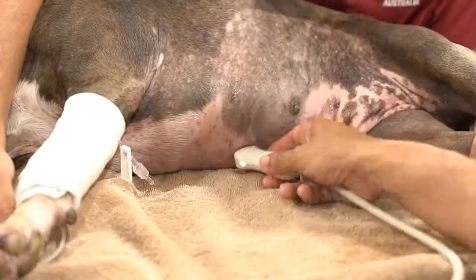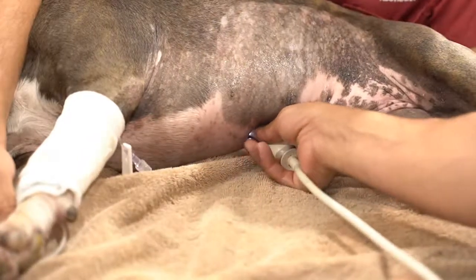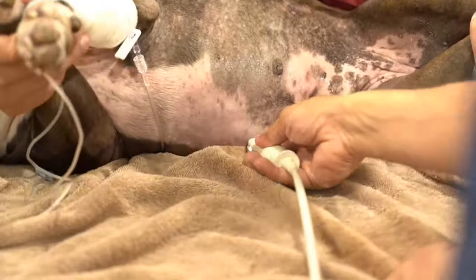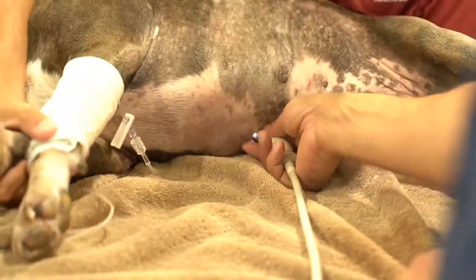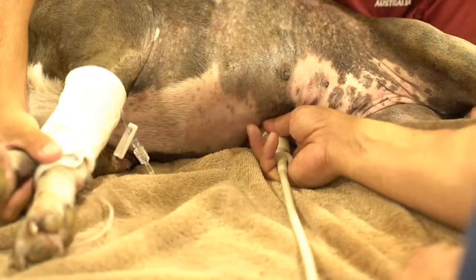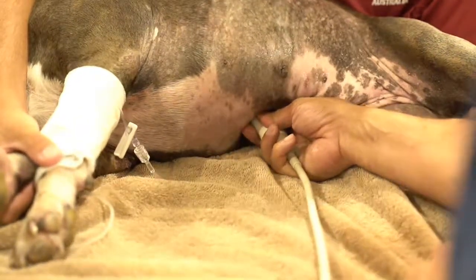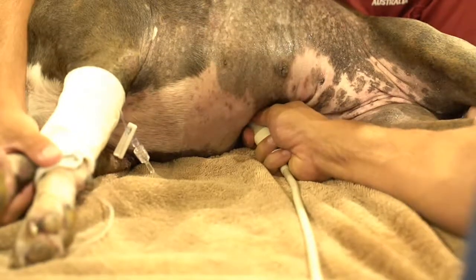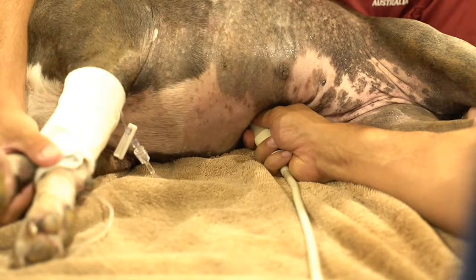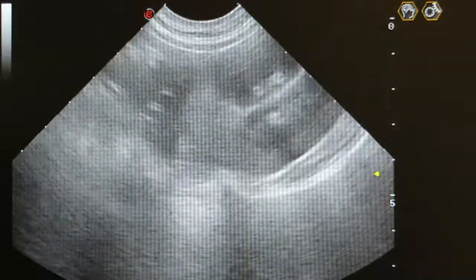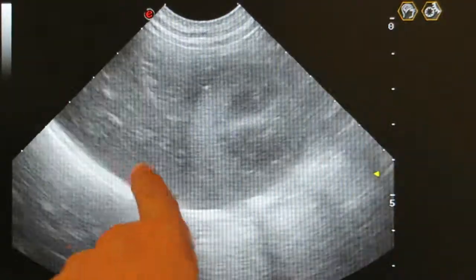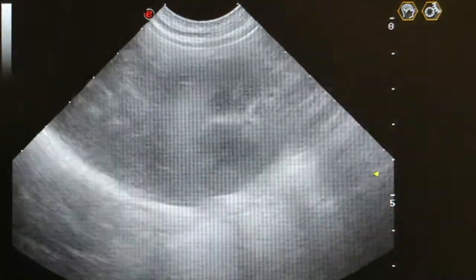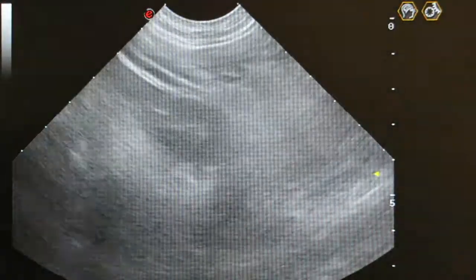The hepatorenal site is quite deep and up under the patient. Tilting to get up underneath. Increase the depth until we find what we're looking for. What we have here is the kidney and the liver, and there's no free fluid around there. Fan around the area.